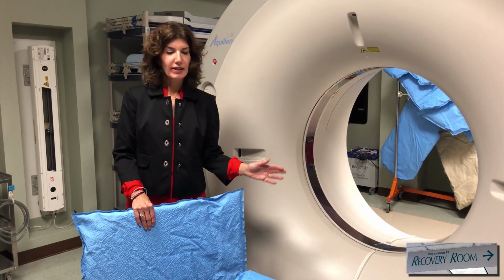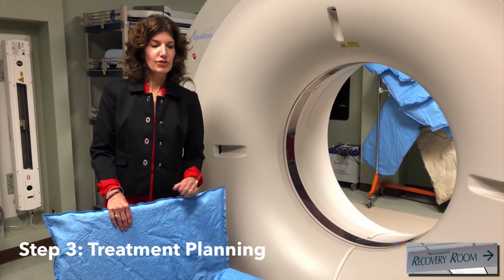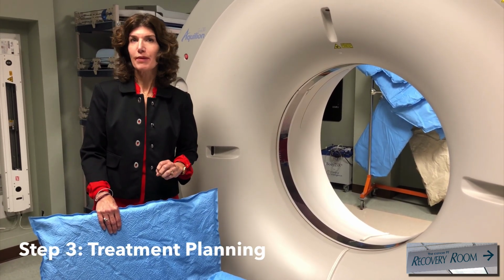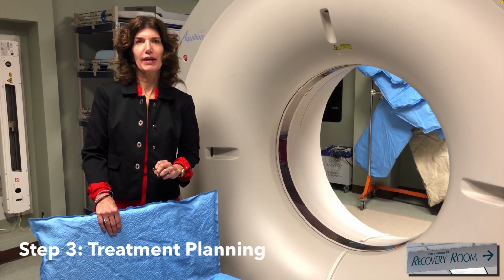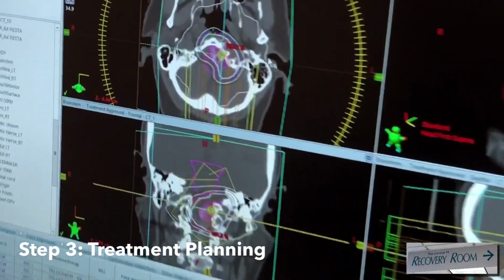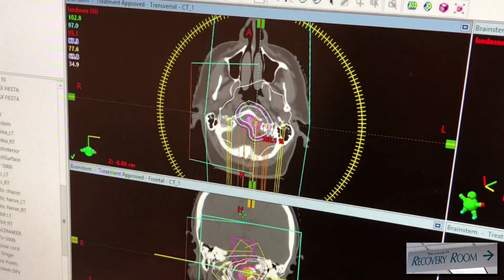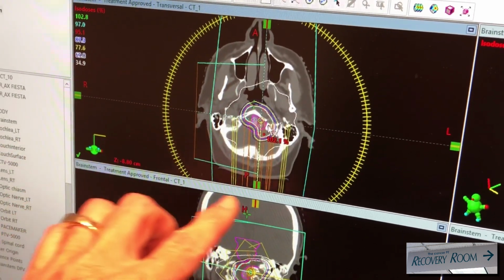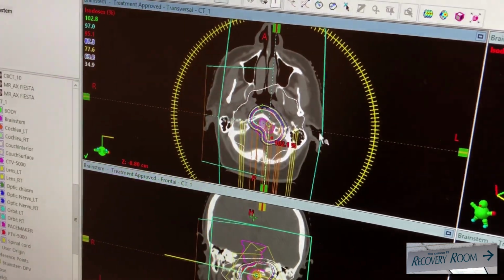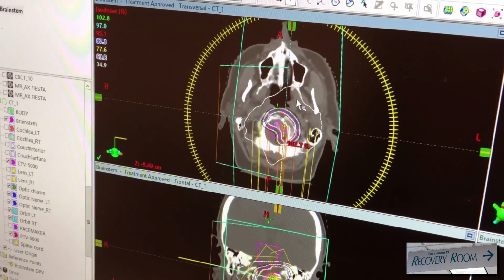So after the patient leaves the department, all the behind the scenes work starts. One of the first things we do is transfer this information, the data set, to a treatment planning computer system, and we work with a dosimetrist who helps me with a radiation therapy plan. I'm working on a plan today, and this gentleman has a benign but aggressive brain tumor. Now, just to give you your whereabouts on this image, this is a CT image. This gentleman is lying on a table. That's his nose right there, and his ears you can kind of see flopping out here, and these are his nasal passages and nasal sinuses.